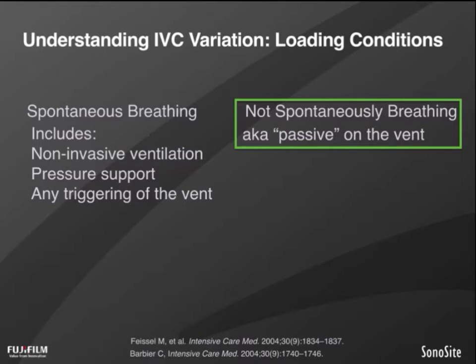It's complicated. The IVC is easy to generate the image. It's perhaps the most complicated of everything I've spoken to you about yet to interpret accurately. There are lots of people who are very enthusiastic about this, but I would submit humbly that I believe the great majority of people have some confusion about how to clinically integrate their findings.